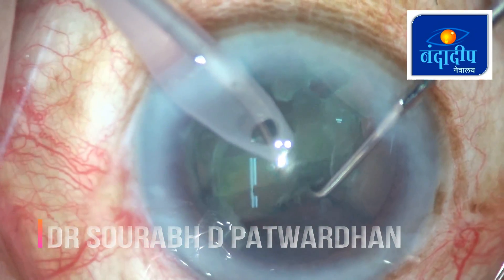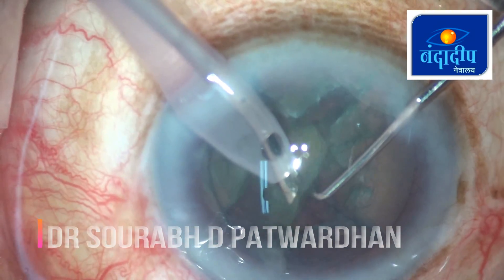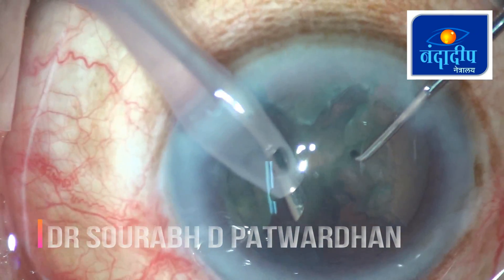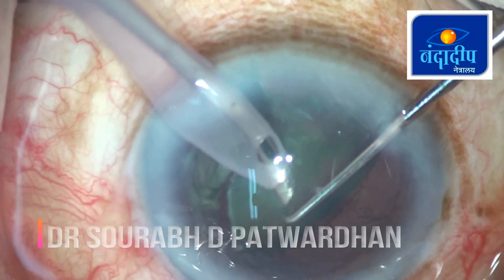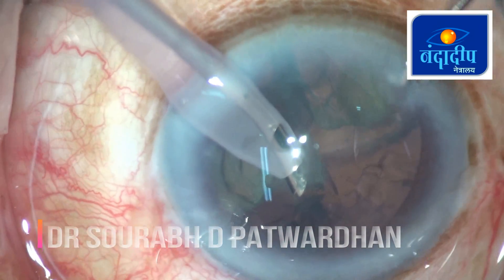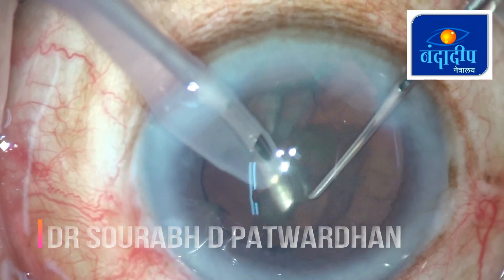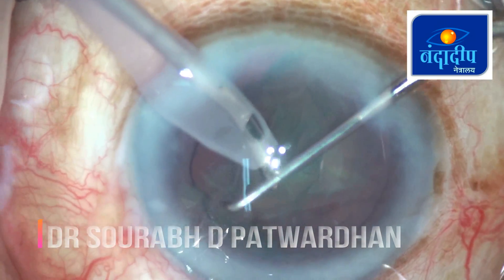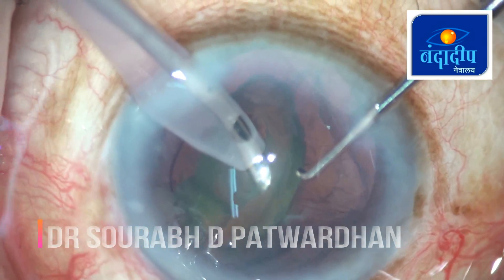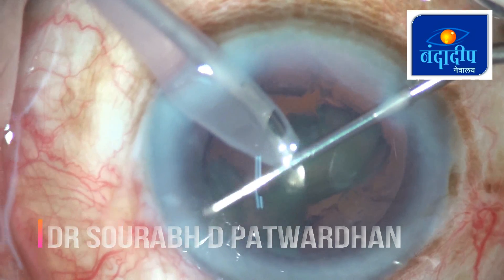Once these pieces are free from each other, you can find that it is now very easy to remove the divided nucleus part. Just use the bevel down feco probe and high aspiration, and the pieces will start flying towards the feco probe. Do these maneuvers properly and avoid creating a bowl. Thank you.